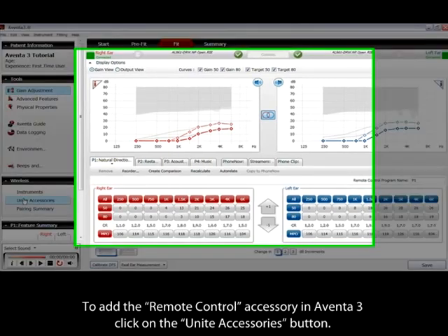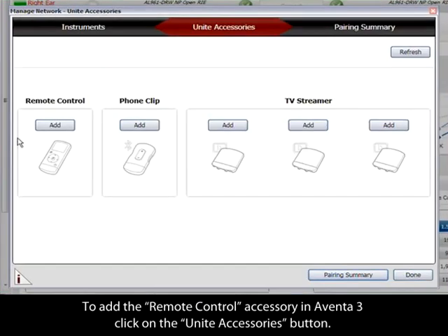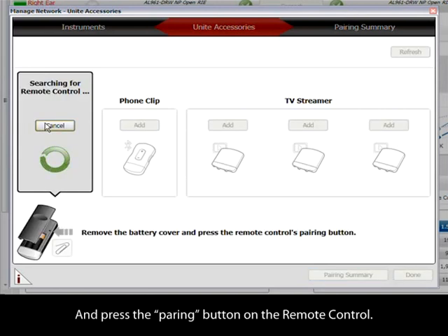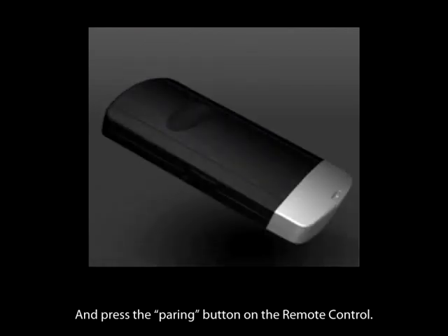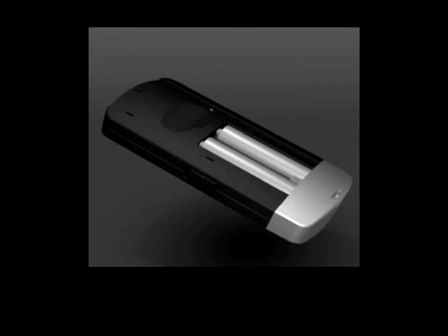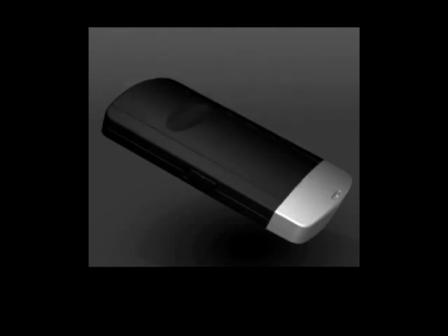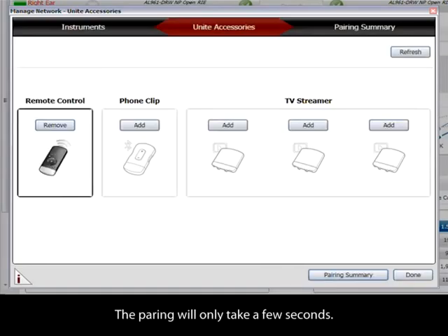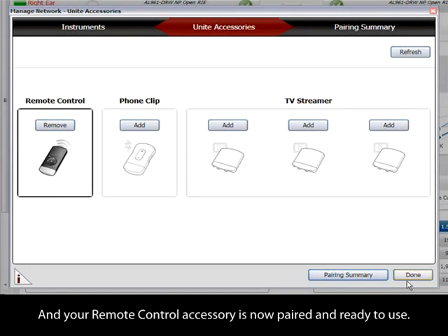To add the remote control accessory in Aventor 3, click on the Unite Accessories button, click on the Add Remote Control button, and press the Pairing button on the remote control. The pairing will only take a few seconds, and your remote control accessory is now paired and ready to use.